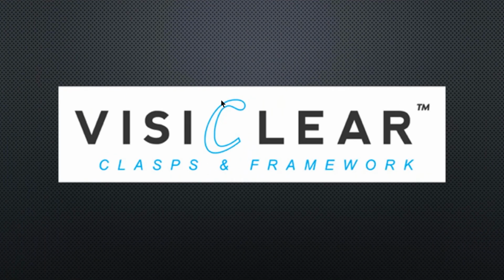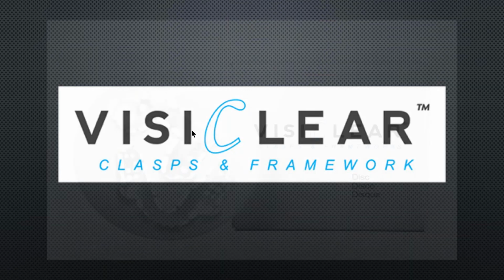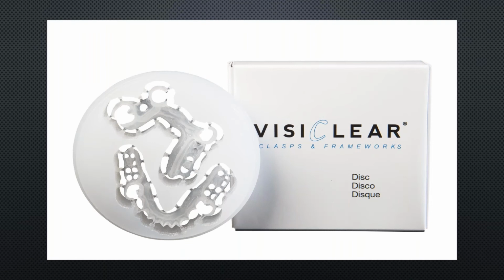So what we're here to talk about is the VisiClear material. The VisiClear material is a mostly clear plastic. The name has clear, and it is not optically crystal clear, and that's a good thing. Optically crystal clear materials in the mouth show shadows. When you're in a dark, shadowy environment, the clear literally absorbs that.